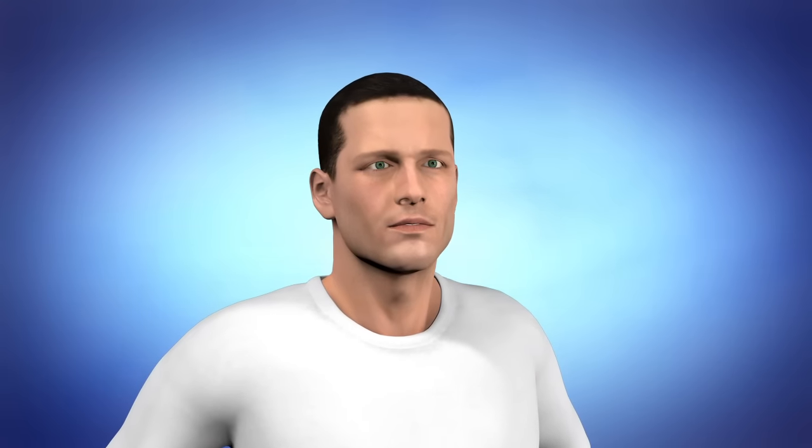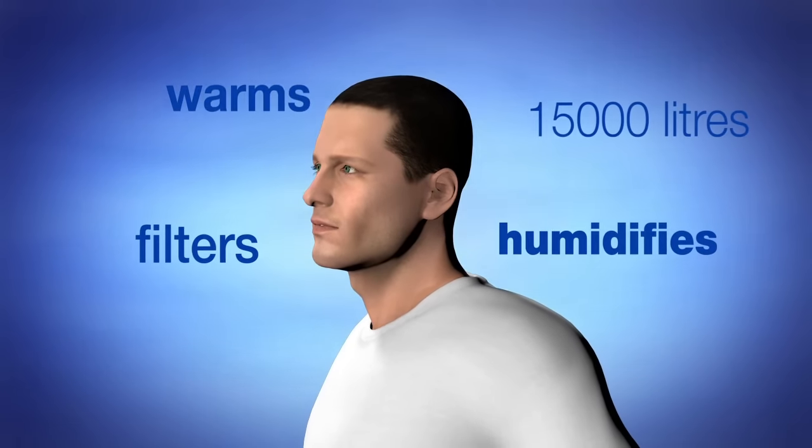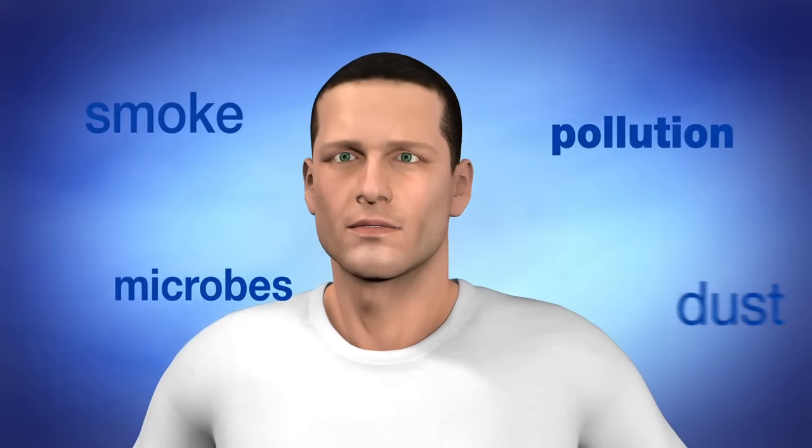The nose is a sensitive organ that needs care and attention. It warms, humidifies and filters 15,000 litres of air a day and is the main barrier against harmful particles that you may breathe in, such as microbes, pollution, smoke and dust.